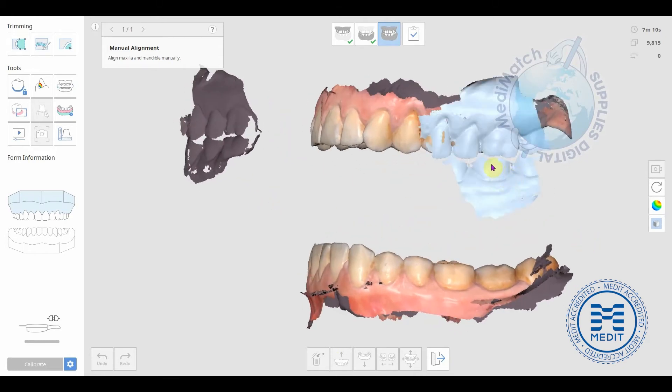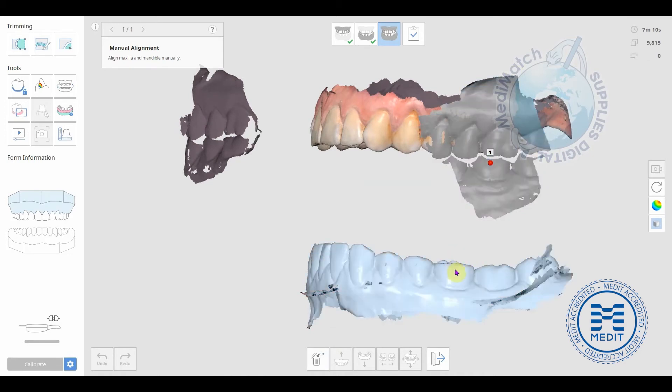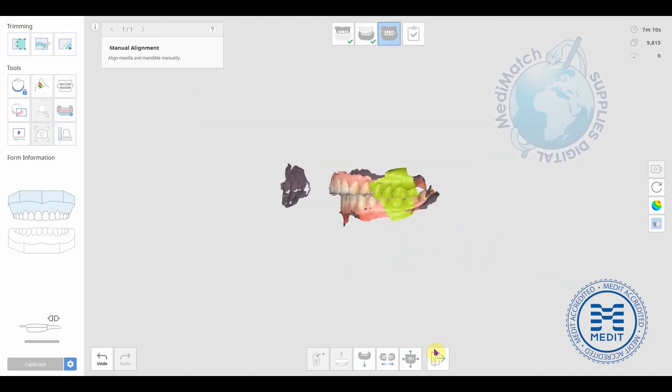So, for example, we can click a point here on the bite scan, and then the corresponding point down here.